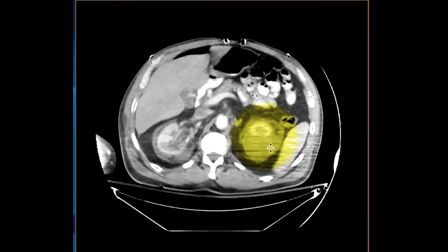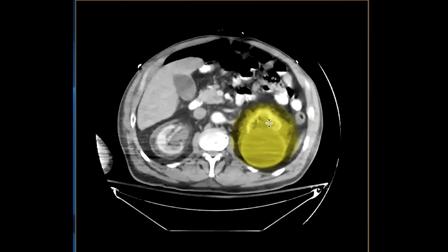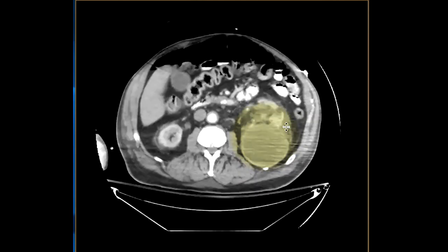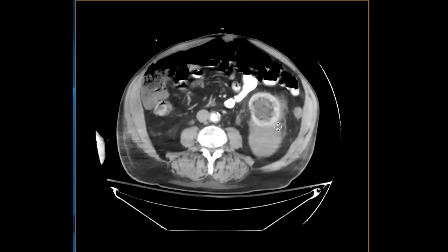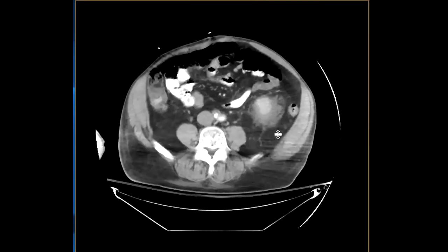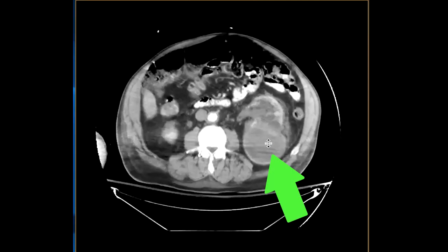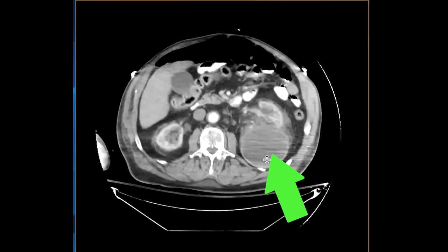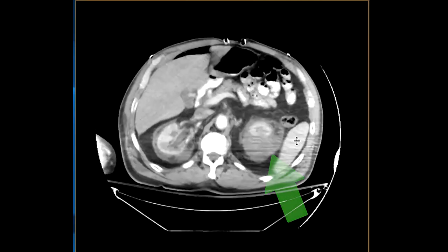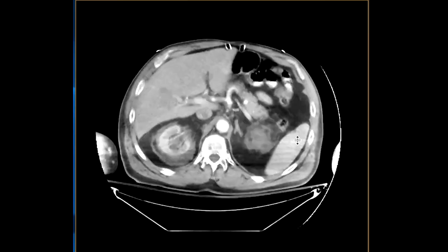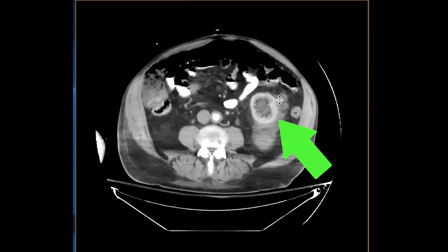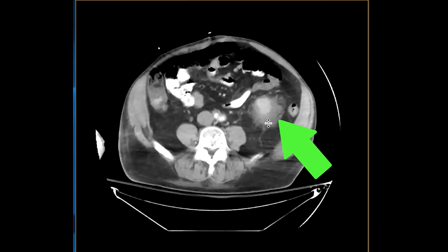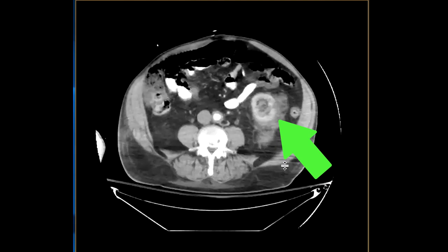Look at the left kidney, and you notice that it's present there as well. Some of this may be more difficult to appreciate because there's a large cystic mass. But if we take that away and focus on everything around it — look at the bottom of this kidney — you have soft tissue surrounding it over here.